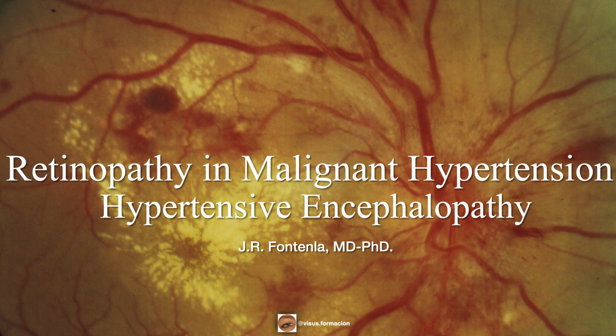In this video, we are going to see the ophthalmoscopic characteristics of retinopathy associated with malignant hypertension. This is the case of a 43-year-old male patient with malignant arterial hypertension and hypertensive encephalopathy.